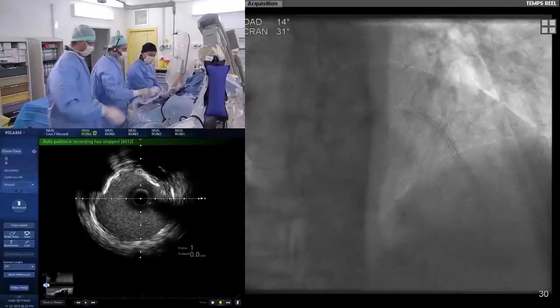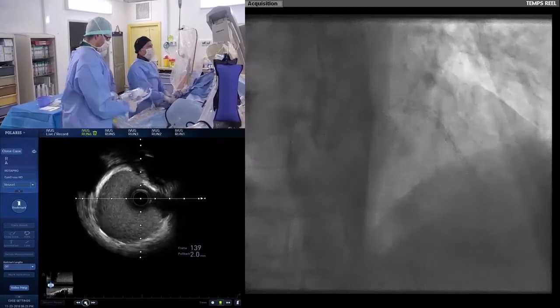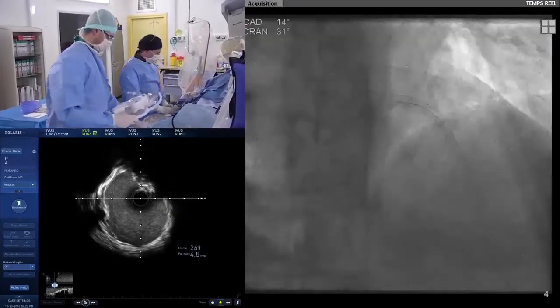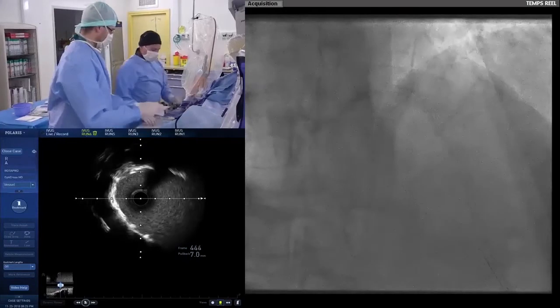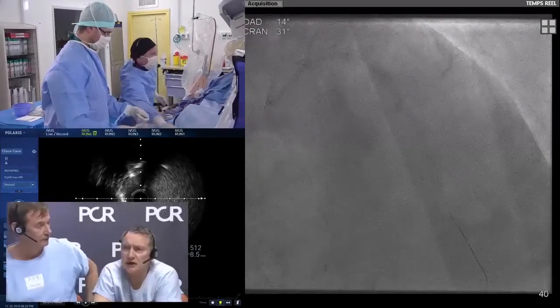Okay, you are sure because you have dilatation with a 5.5 non-compliant balloon. Okay. So and now we will do the final shot. If you want to discuss, we have some cases or some tips and tricks to share. Just a tip and trick, Nicolas.